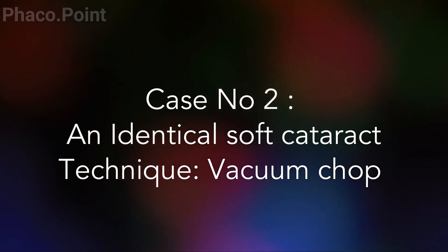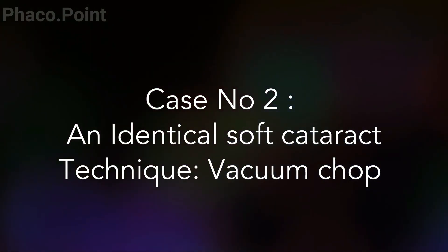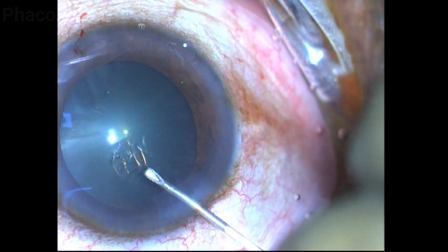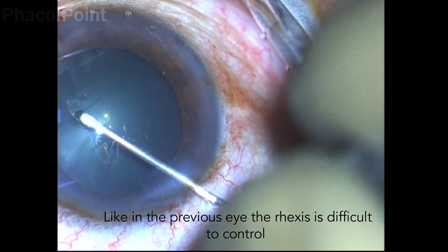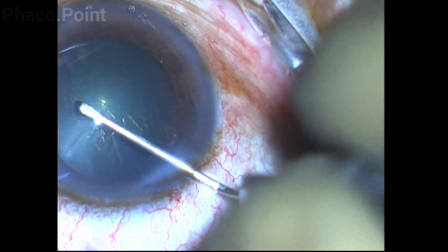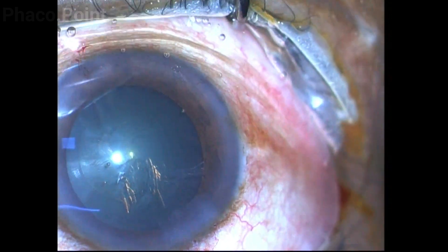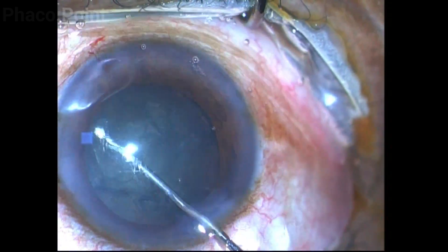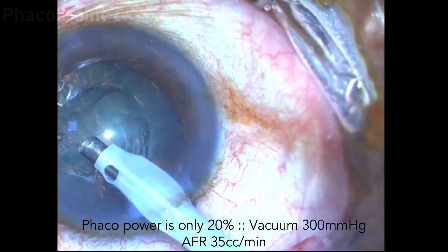Now let's look at an identical cataract and manage it by a different technique — the direct chop technique using just vacuum, which I call the vacuum chop technique. Again we try to create an almost identical capsulorexis; these were two eyes of the same patient. The rhexis is tending to run away, so I use centripetal pull to bring it back into control. Once the capsulorexis is completed, a cortical cleavage hydrodissection is carefully performed and a rocking maneuver is also done to make sure the lens will rotate.